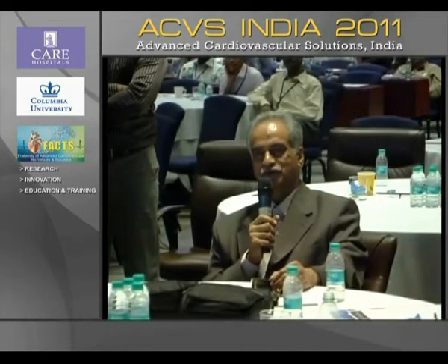I think Dr. Somaraju has a question as well. See, originally you deployed the stent which was 4 millimeter diameter, and your covered stent was what, 3 or 3.5? So how did you think that the vessel, which was already dilated to 4, would work with a 3.5?